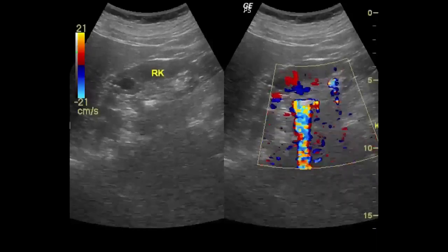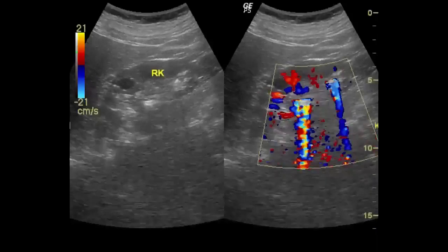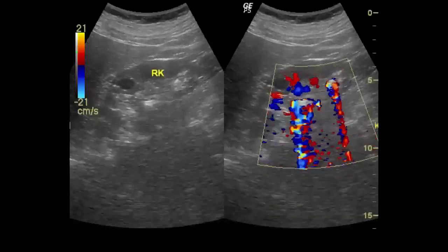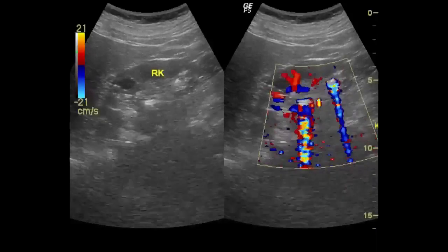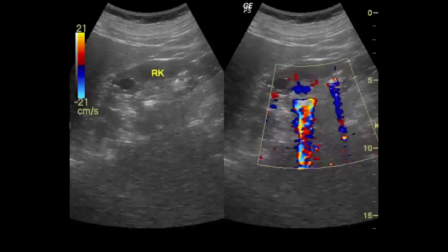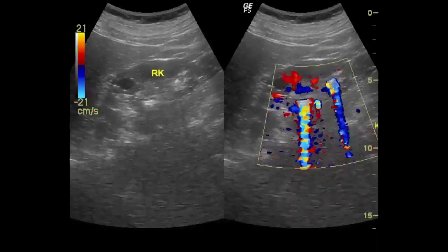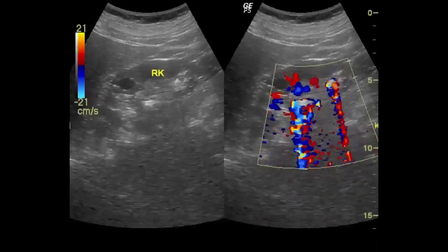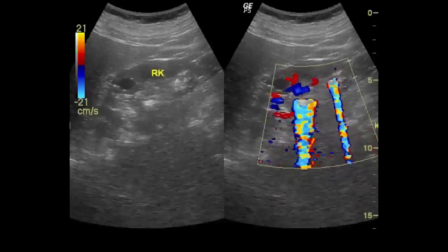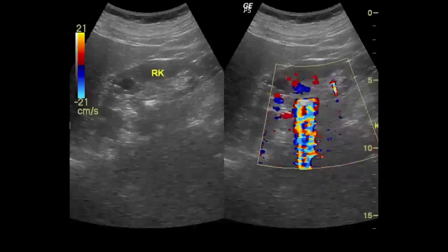The twinkle sign is a color Doppler ultrasound artifact described behind calcifications, presenting as a random color encoding in the region where shadowing would be expected on grayscale images. A recent study has reported that the twinkle artifact sign may be useful for detection of urinary stones.